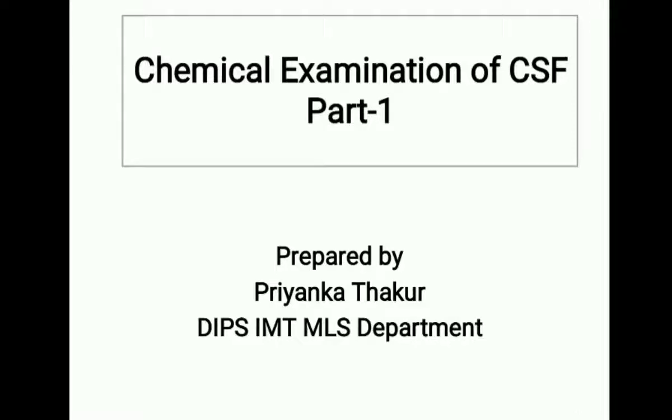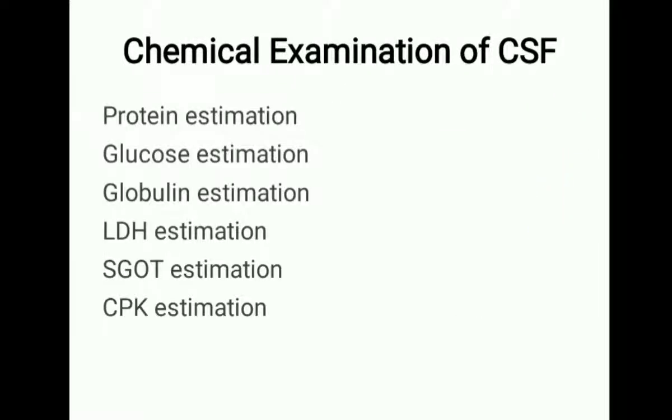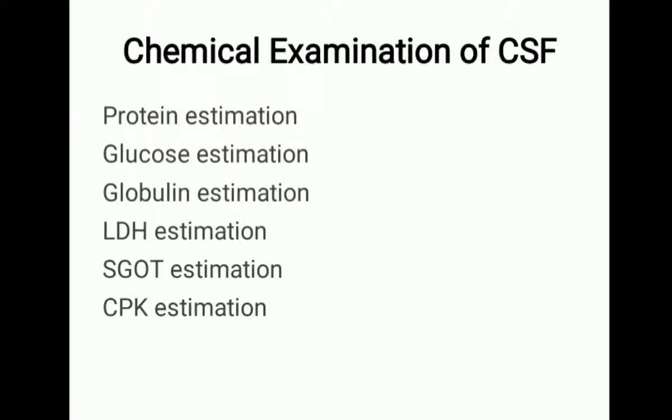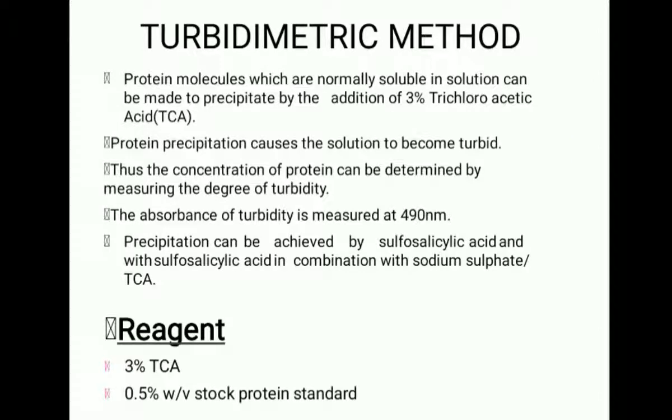CSF. In chemical examination of CSF, we perform different tests to estimate protein, glucose, globulin, and some enzymes: LDH, SGOT, and CPK. So firstly, we will discuss the estimation of protein.